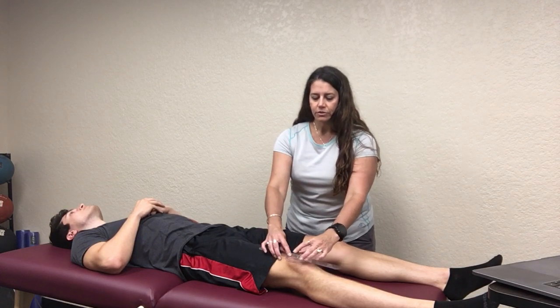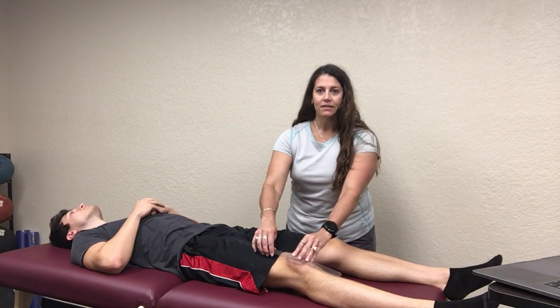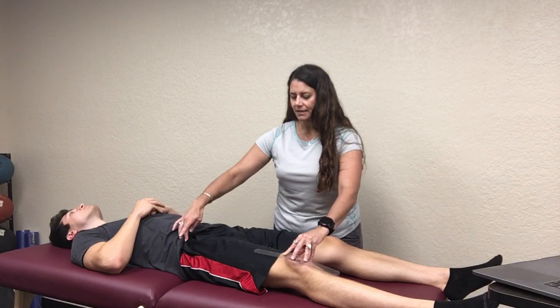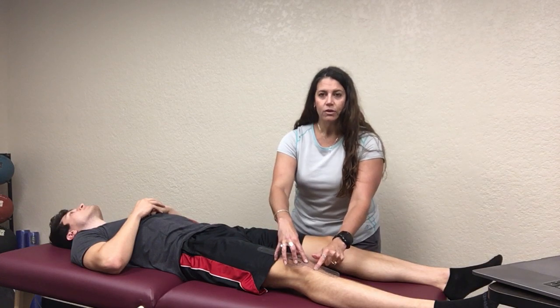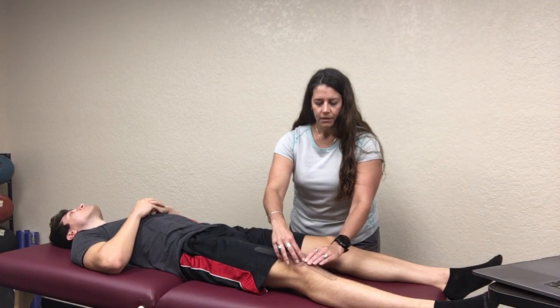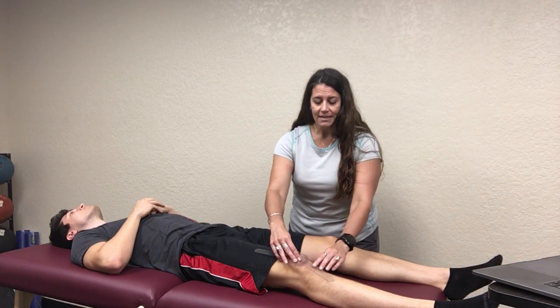And then what you're going to do is, oh, I put it on upside down, you're going to take the stationary side and run it all the way up to his ASIS. So you're going to line it up right here, and then you're going to find their tibial tuberosity and then run the movement arm through the tibial tuberosity. So if they were straight, these should be lined up and be at 180.